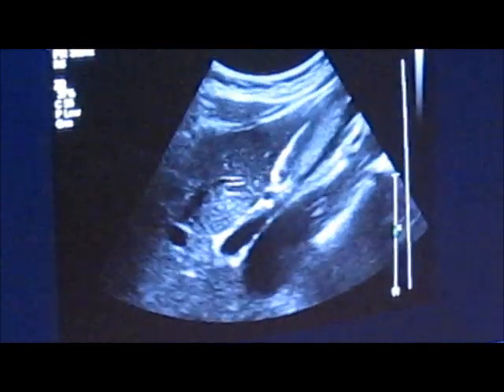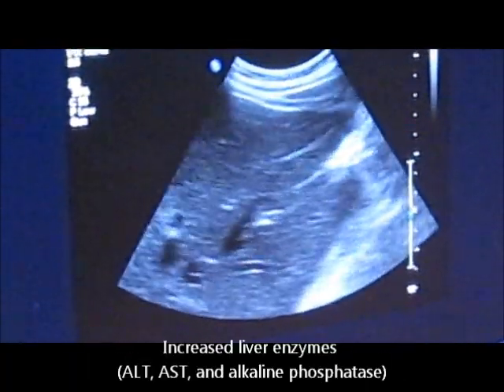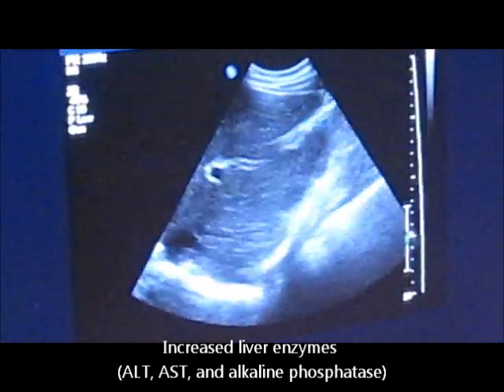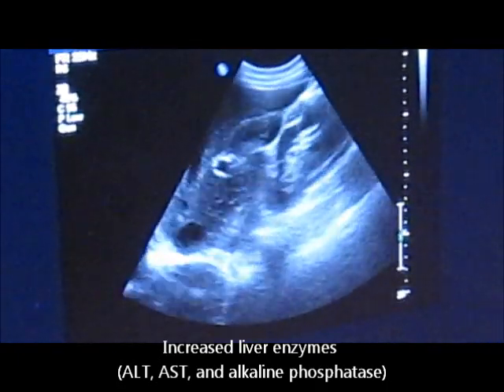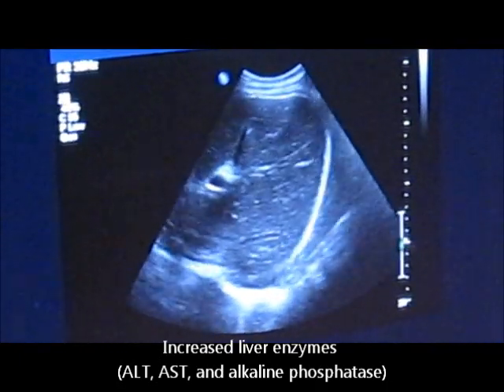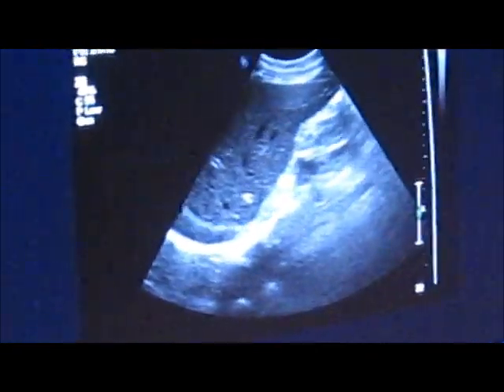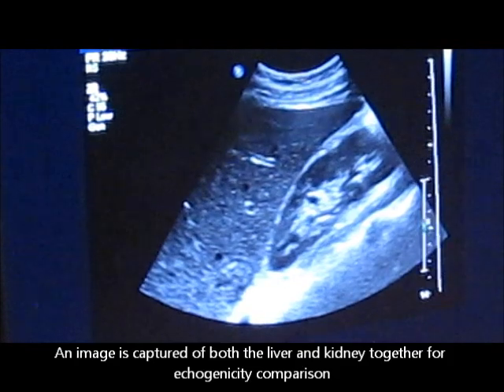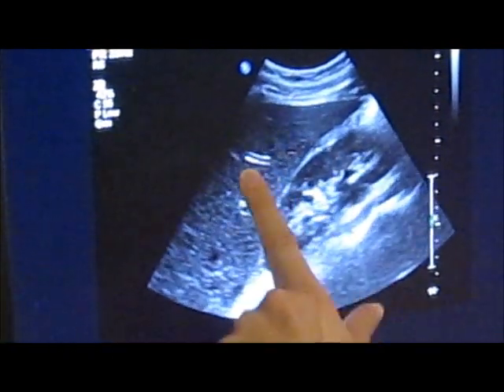From there we go to the liver, which is one of the larger organs in the abdomen. So we'll look at the liver a lot for increased liver enzymes, your ALTs, your ASTs, your ALK-PHOS, all of those will be elevated. So what we look for is the liver should be pretty close in density-wise to the kidney, which is right here. So we get a side-by-side picture. They should look pretty similar. So this is the right kidney, this is her liver.